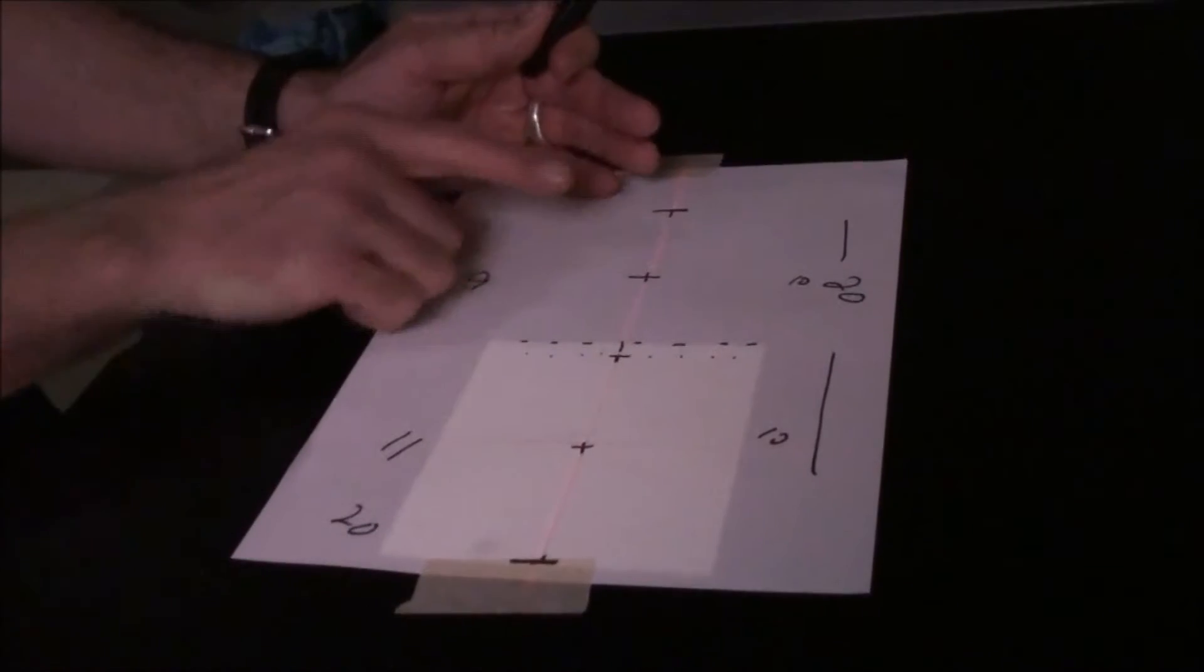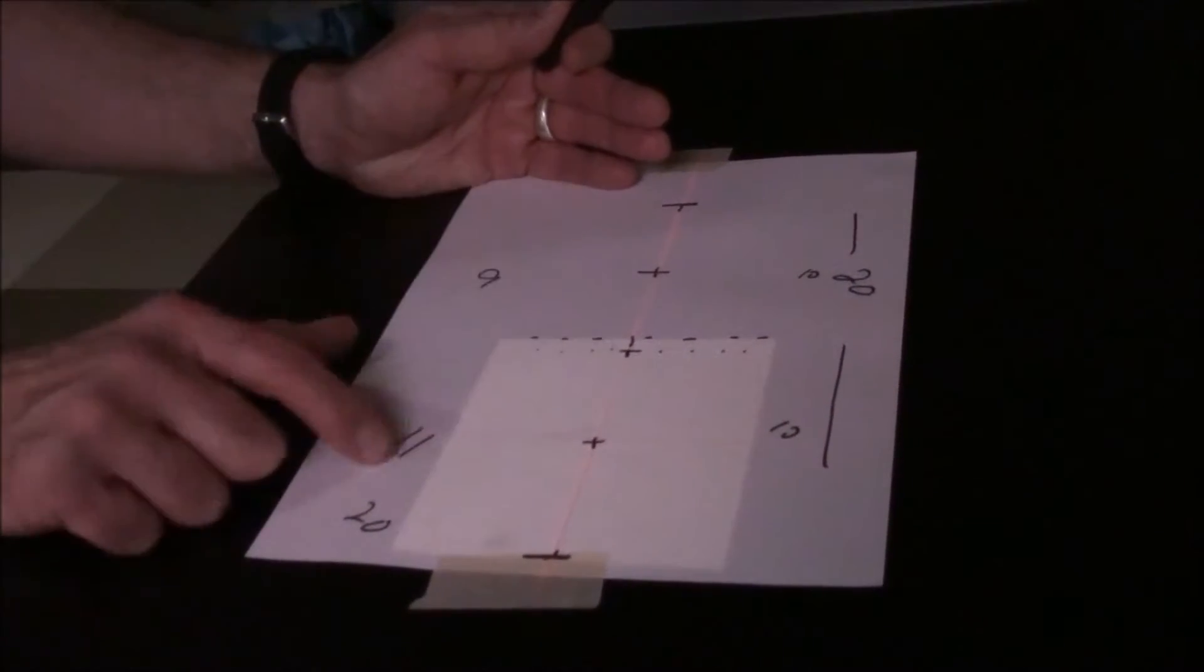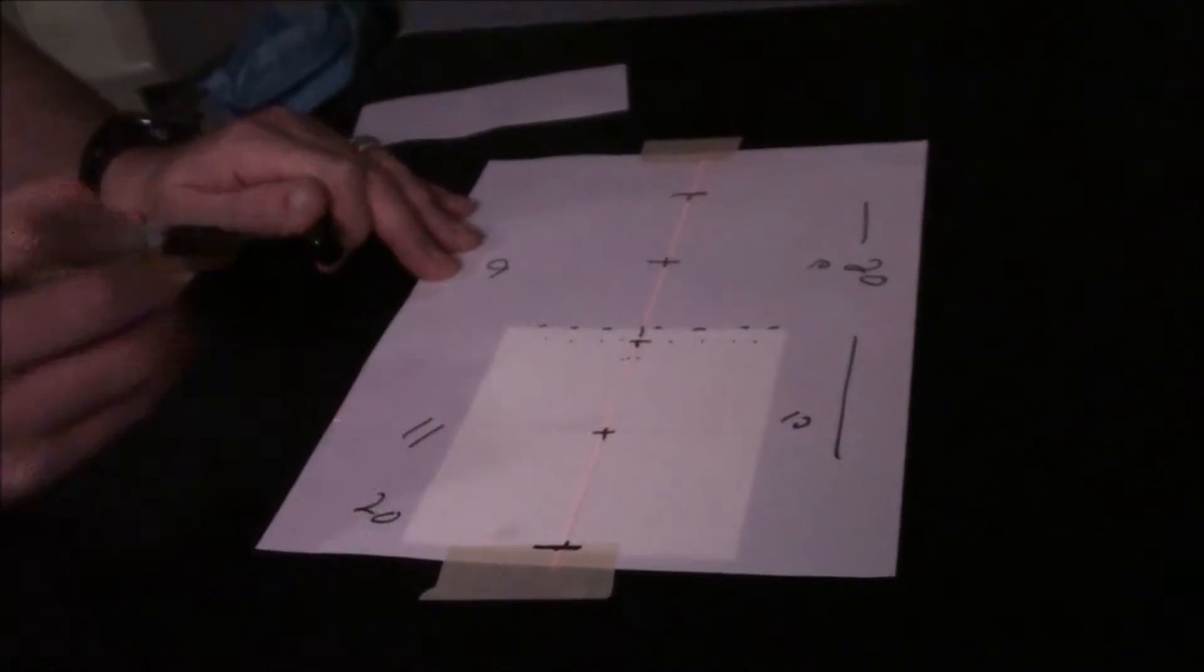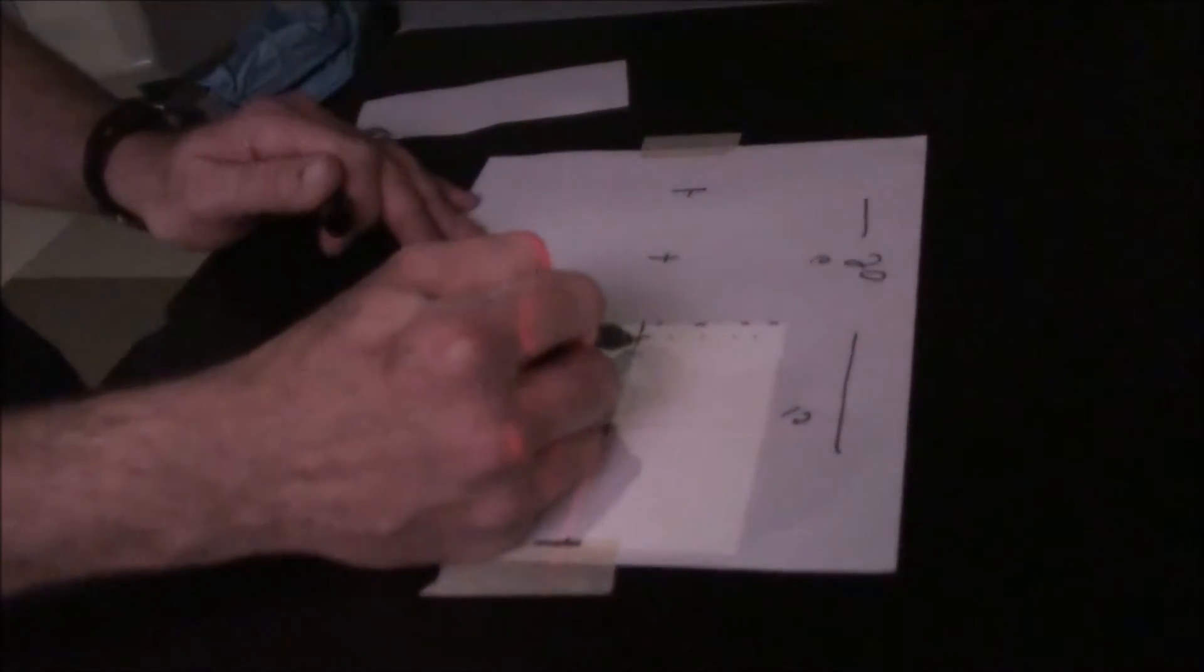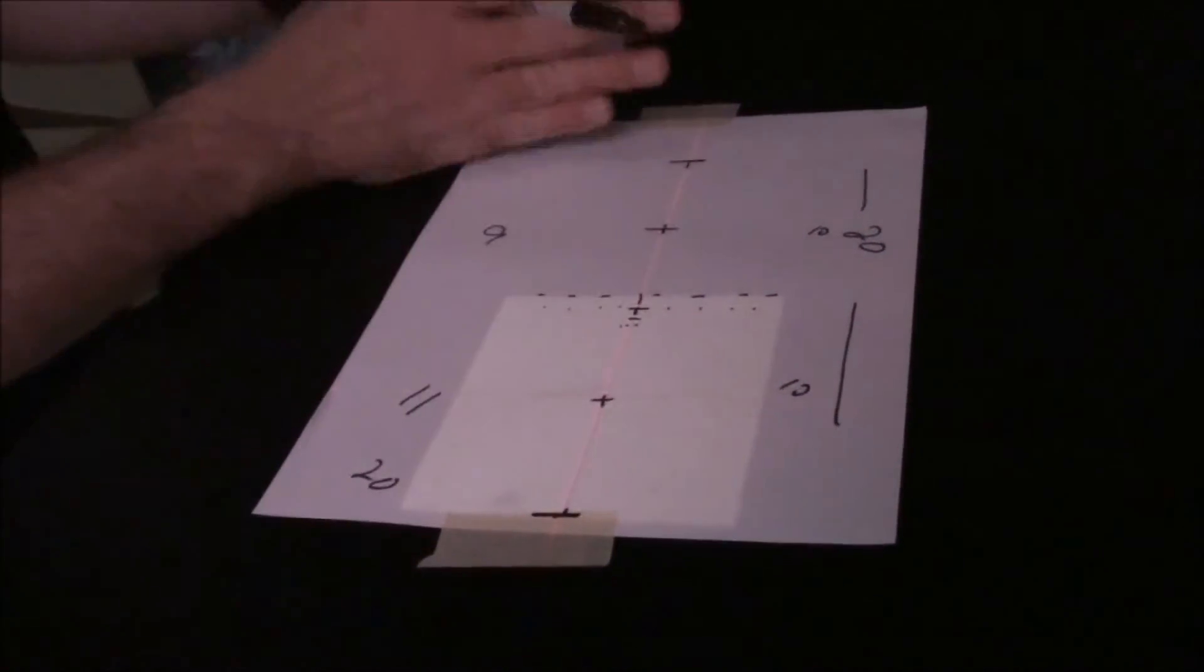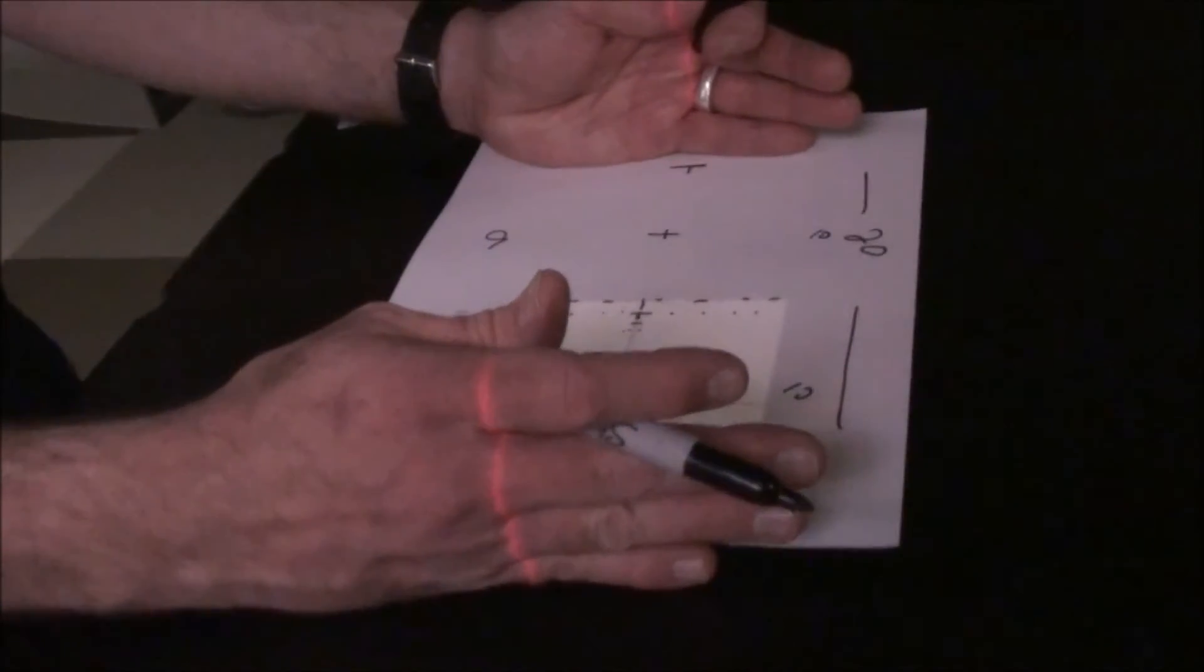So no matter what you do, we can flip-flop these to where this one becomes 11 and this one becomes 9, and that will put us down here. When we move the field size itself, it's only going to put it to right there. We'll have to do field size and table shift in order to maintain the superior and inferior border.